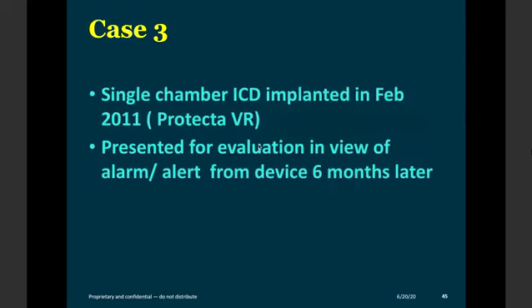The third case: a single chamber ICD implanted in February 2011 presented for evaluation because the patient received an alarm. Alarm meaning a sound which comes from the device at a prescribed time, telling him that there is a problem, go meet the physician. Or it can also be done by remote monitoring using the current day remote monitoring devices. The clinician will be alerted even without the patient having to come to the clinic.